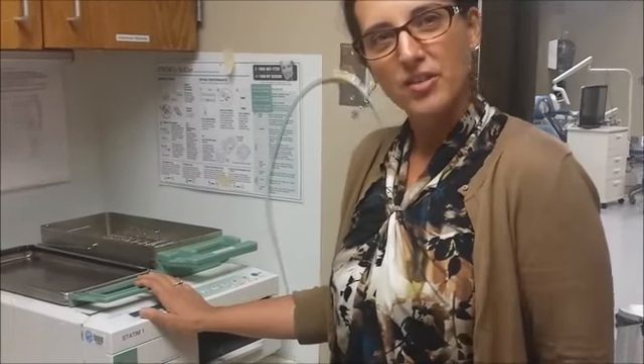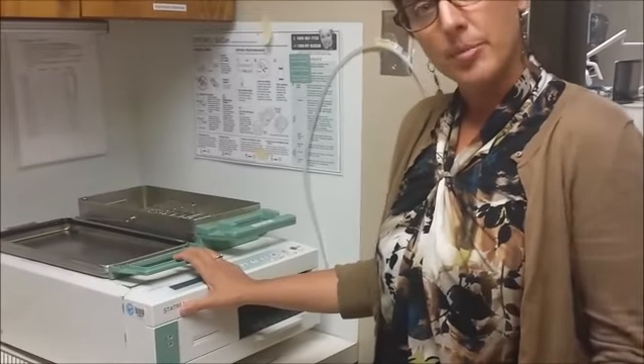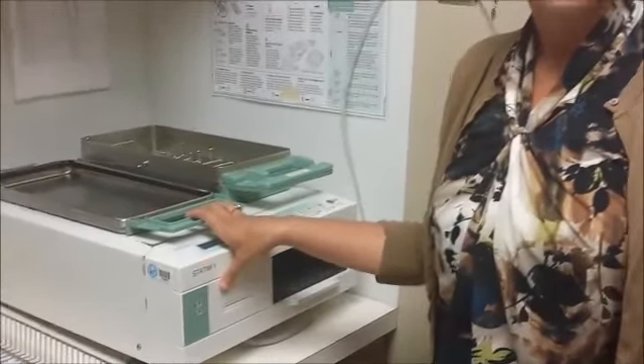Now we are going to learn how to use the Statim autoclave. I'm going to start by showing you where a few of the key switches and buttons are that you might need to access.